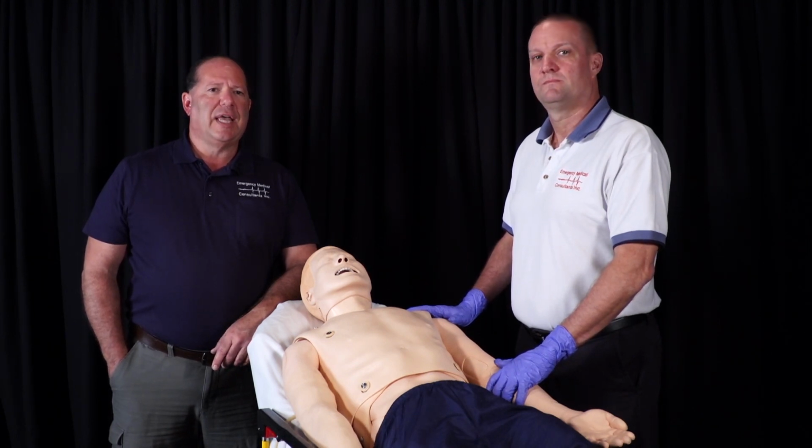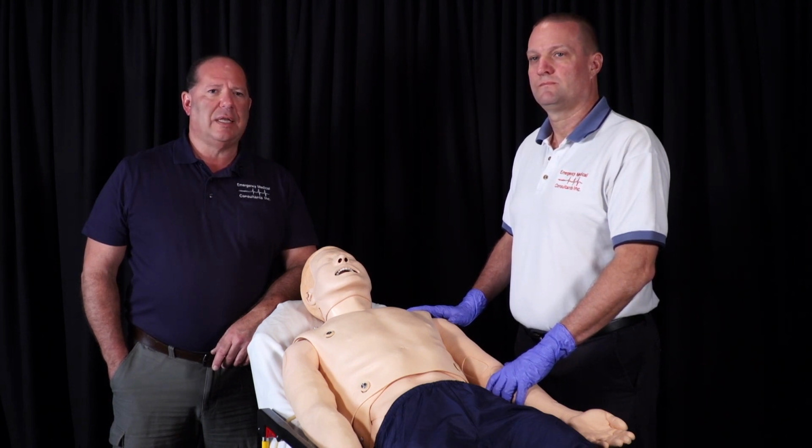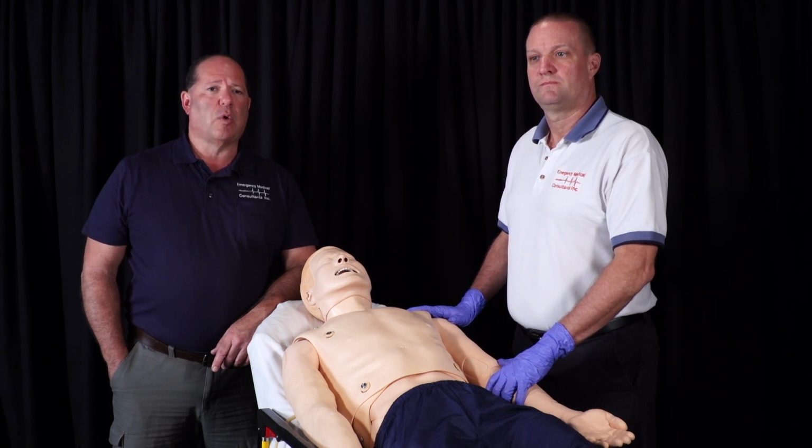The patient who has a chest injury and displays respiratory distress that is getting worse, also has diminished or absent lung sounds on one side, and has hypotension or decompensated shock, which may be recognized simply as no radial pulse. Remember that for this course, the patient must have all three of those in order to qualify for needing a needle placed in his chest. We'll look at the landmarks and then we'll go through the procedure.